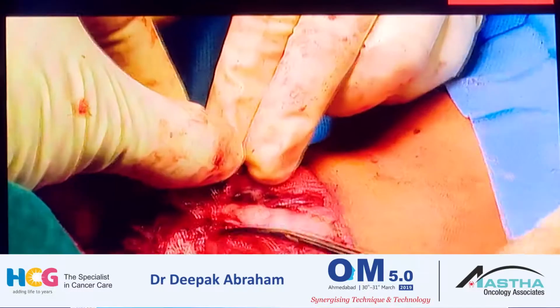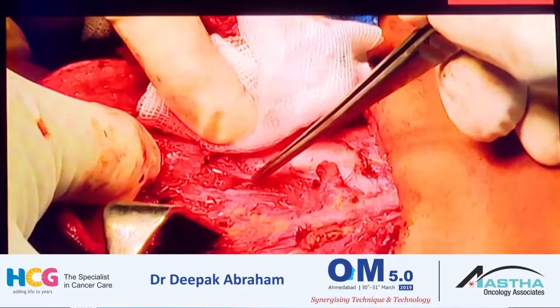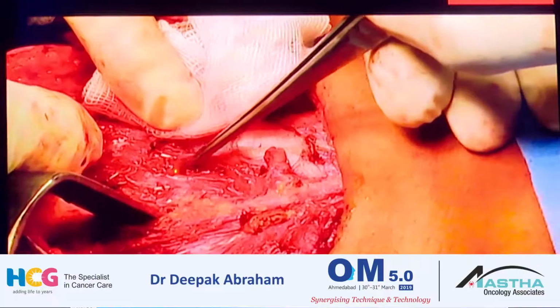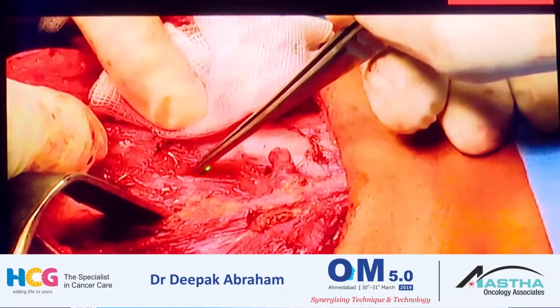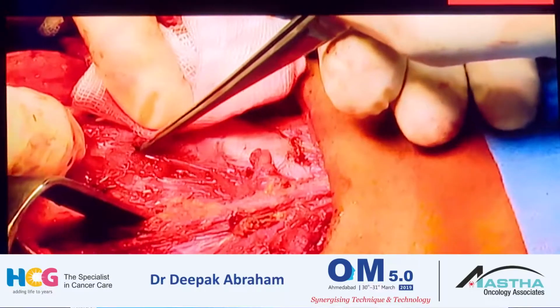And then you can see that you've got a clear plane there, and the well vascularized inferior para and the superior there. The superior actually sits between two branches of the nerve. That's the anterior branch and that's the posterior branch, with the parathyroid sitting in between.